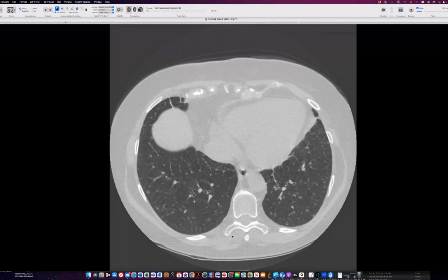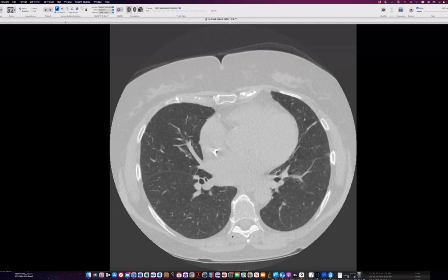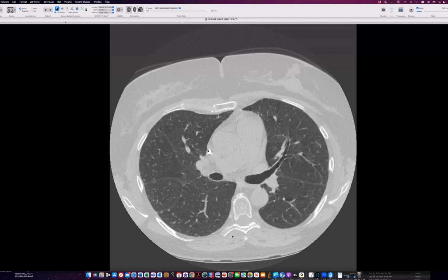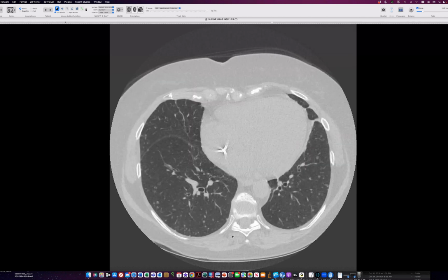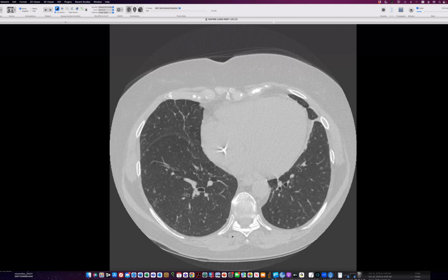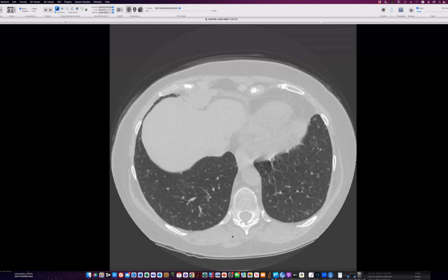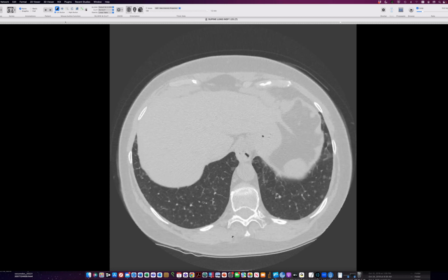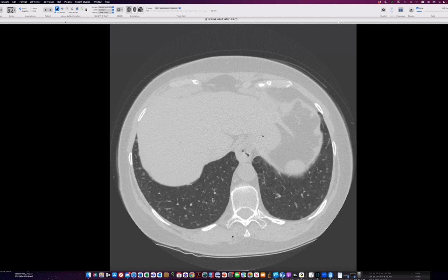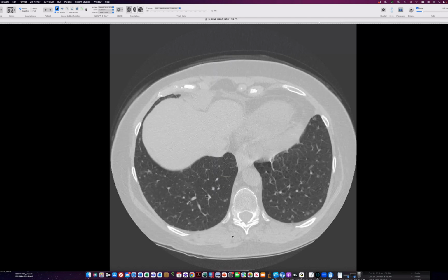So I looked up the description of nodules that occur with amyloidosis, and nobody has nodules of this profusion and this small size. Usually the lung nodules we see with amyloid are big and sort of irregular blobs. And there is often accompanying cystic or emphysematous lung disease, as Howard has documented. So chances are this person has two diseases here. In addition to the cardiac amyloid and the plasma cell dyscrasia, there are these meningothelial-like nodules. I don't really think that these nodules are likely to be amyloid. What do you guys think?